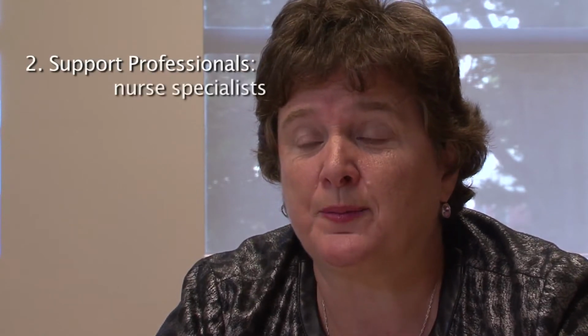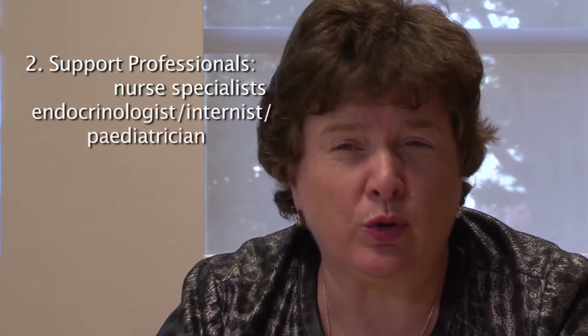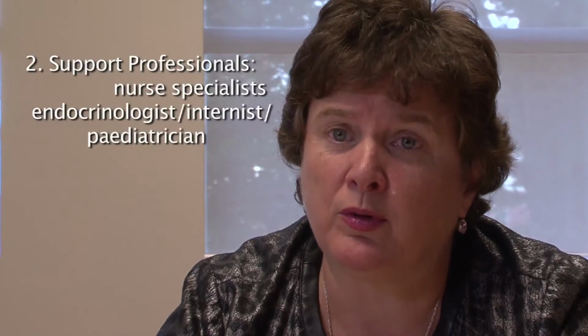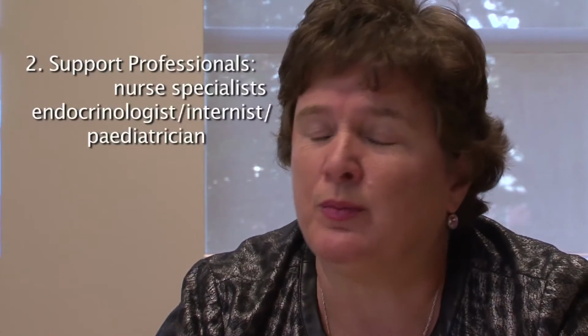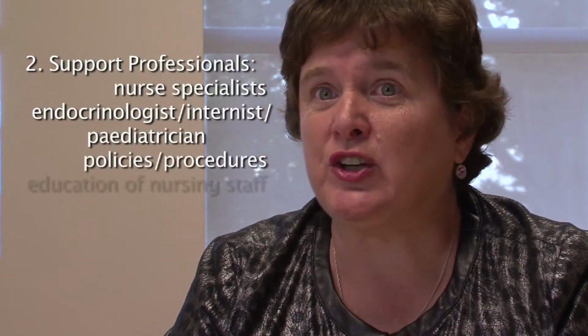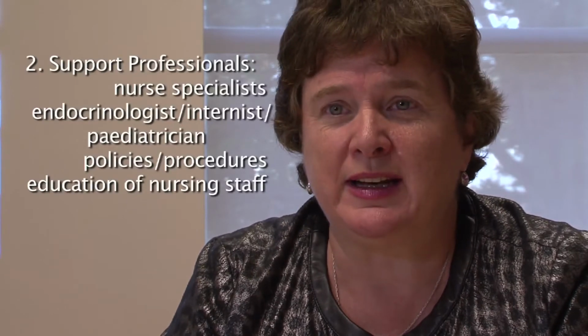The second thing is, do you have the appropriate professionals to support the patient with diabetes while they're in hospital on the pump? That is the nurse specialists from the diabetes center who are pump experts, and either an endocrinologist or an internist with an interest in diabetes who can appropriately help to manage the patient. And you must have appropriate policies and procedures in your organization and have already undergone the education for your nursing staff so they can be comfortable with the concept of someone maintaining or managing their insulin while on a pump.